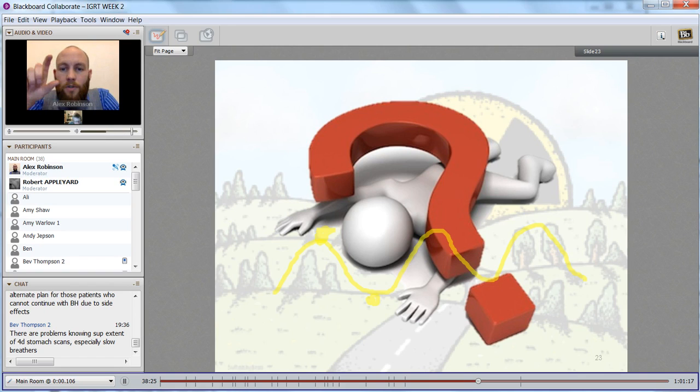The largest areas would be along the heart, the diaphragm, but also our exterior contouring, our axial variations, which then makes it very difficult when we're looking at the effect of the inverse square law for planning and our FSDs, SSDs, whatever you want to call them.